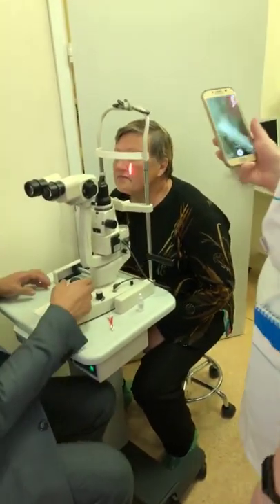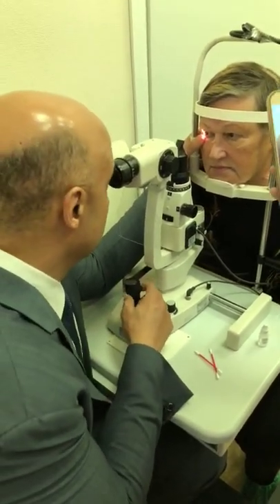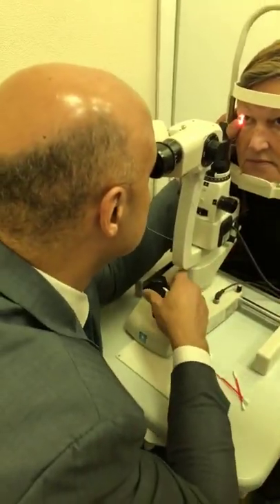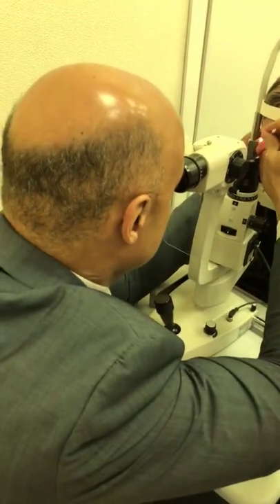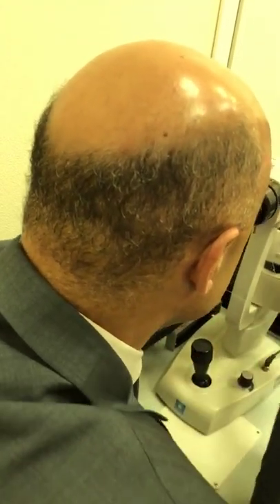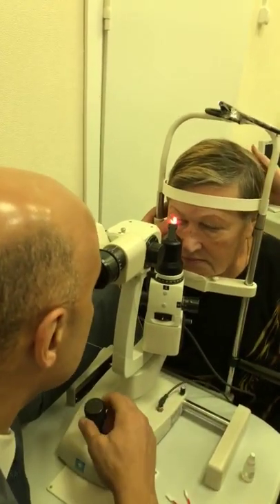So tell her what I'm going to do now is I'm going to express her glands. I gave her a numbing drop, so she should not feel this. But tell her to look up. Yeah, so she's making a whole bunch of toothpaste-like secretions. So she's got bad dry eye. Tell her to bring her forehead forward, and then look up again.